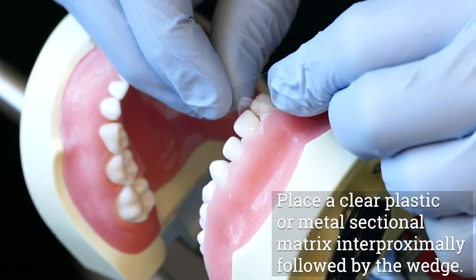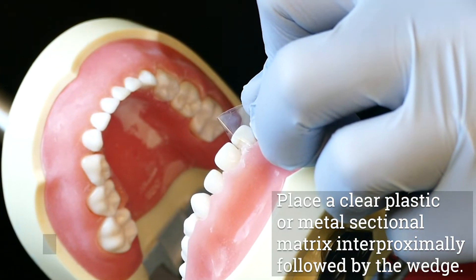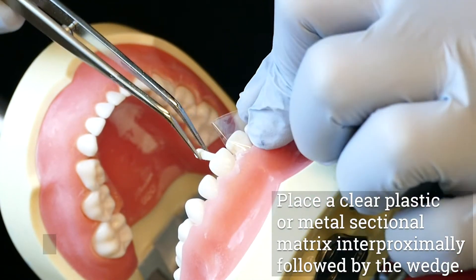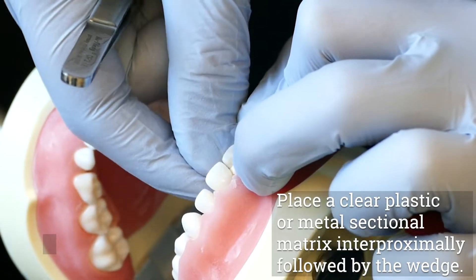Place a clear plastic or metal sectional matrix interproximally and reinsert the wedge. Most plastic matrices will have to be first cut in half horizontally because they are manufactured for permanent teeth and are too wide for primary teeth.